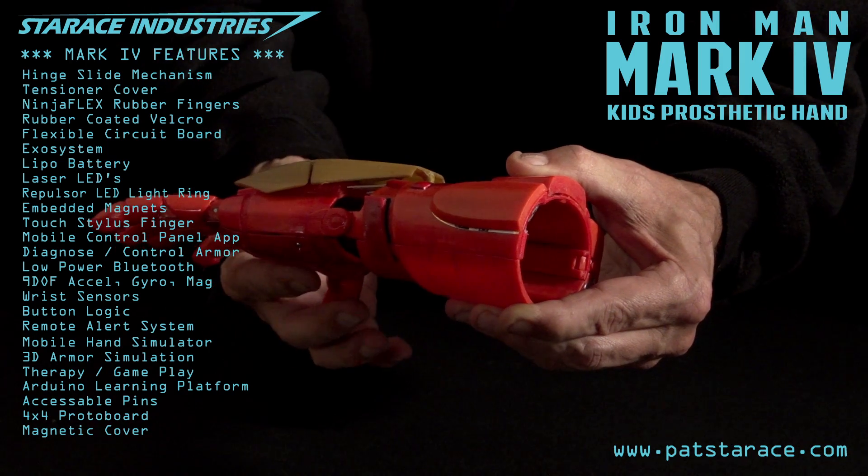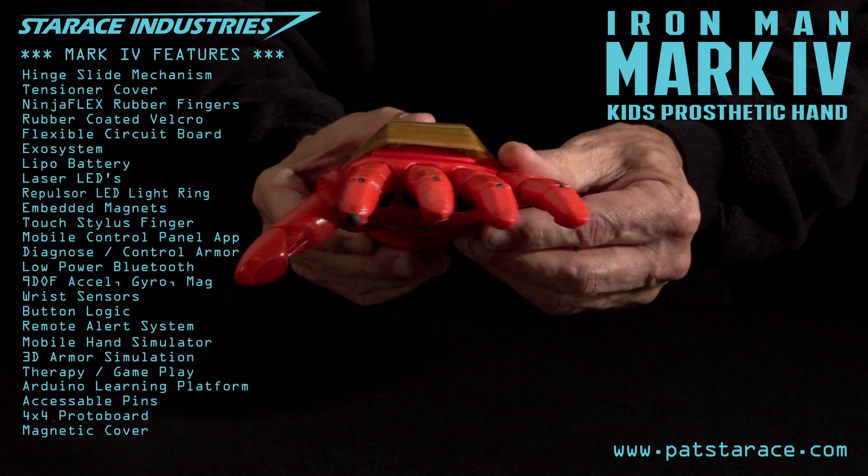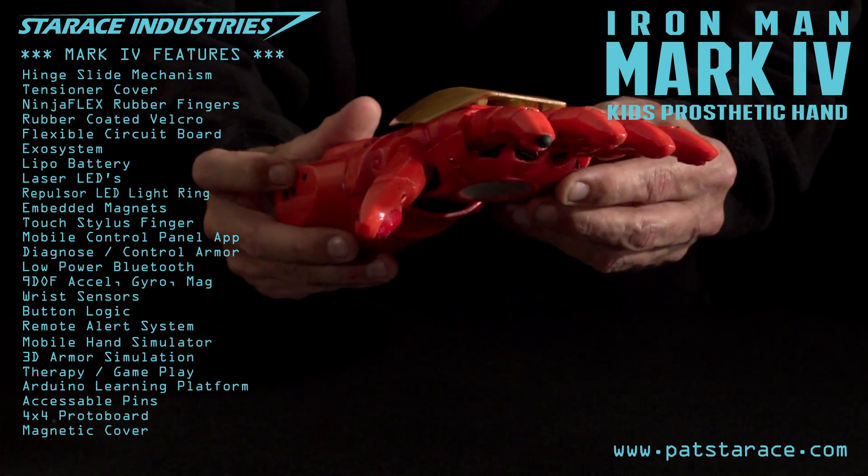And the magnetic cover is a nice touch. Deploy the armor. Sir, not quite yet. Point your hand at the television set and press the buttons on the side.